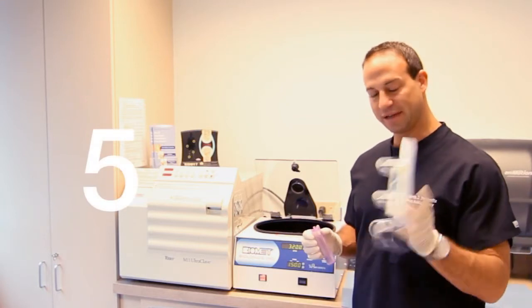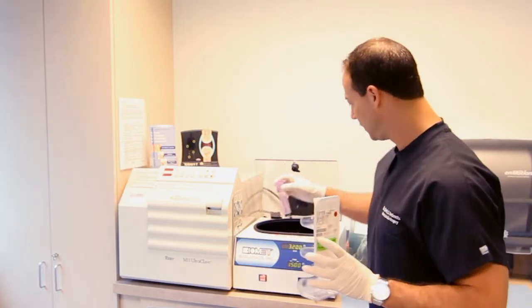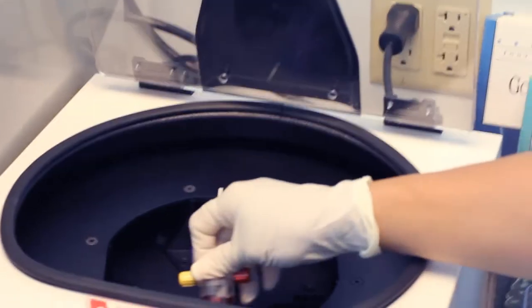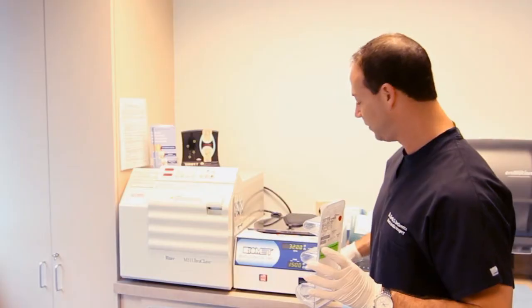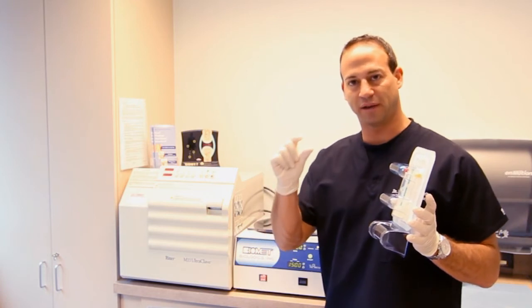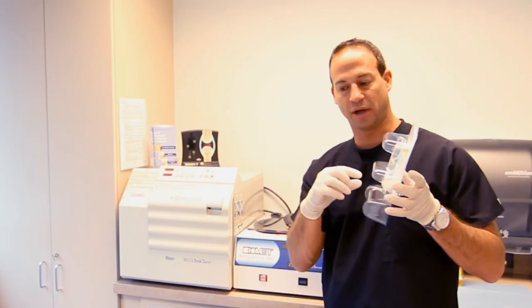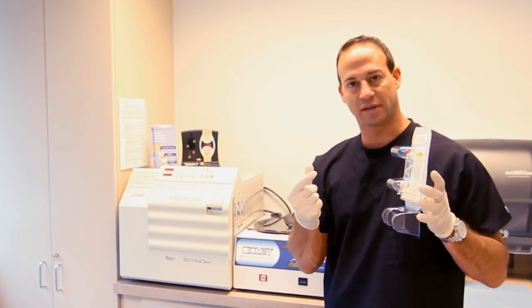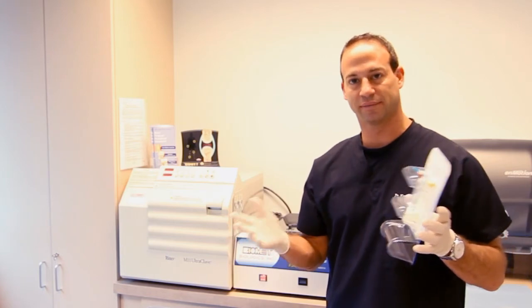Step five, we take the separator — which I'm not going to open because it's sterile and only gets opened after the blood is drawn — and place it inside the centrifuge. Then we close the centrifuge. That runs for 15 minutes. Over the course of 15 minutes, the platelet-rich plasma will be separated from the patient's blood. Then we take three cc's of that plasma and inject it into the surgical or non-surgical area.